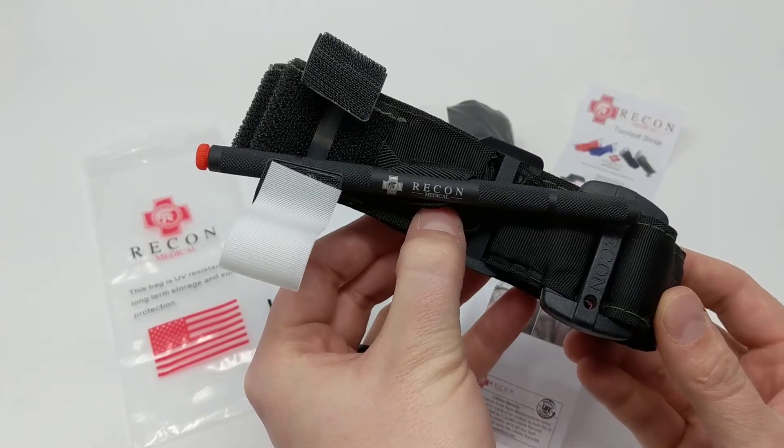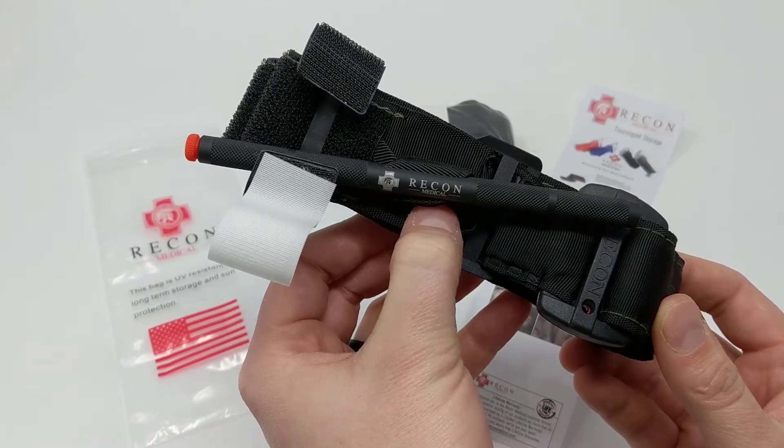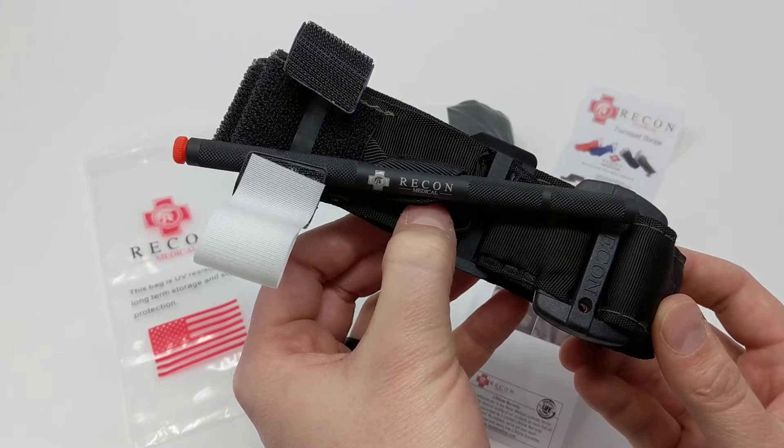This is the Recon Medical Gen 4 Tourniquet. It's one of the most innovative high-quality tourniquets available on the market today.